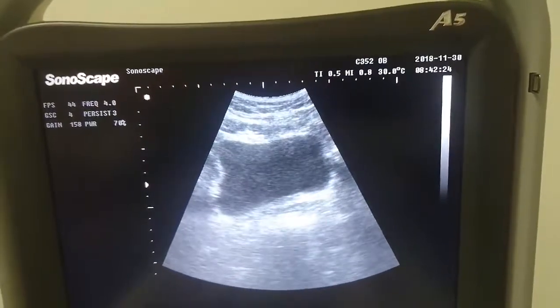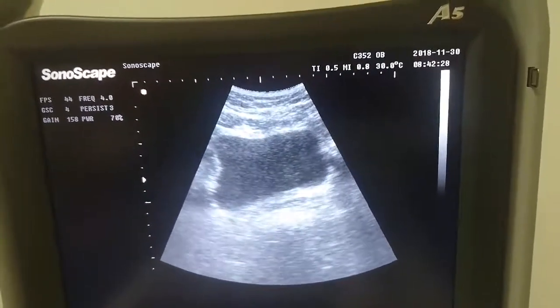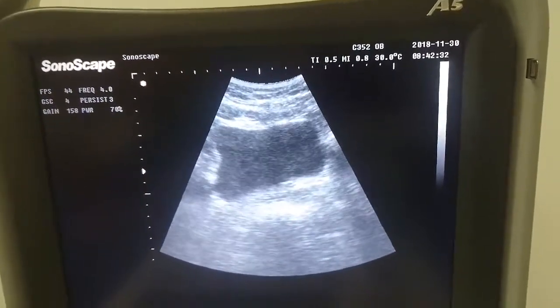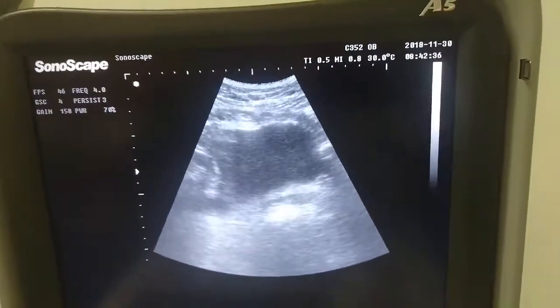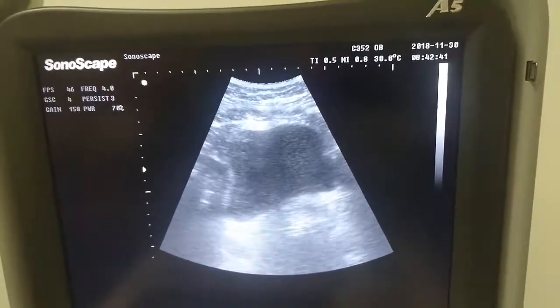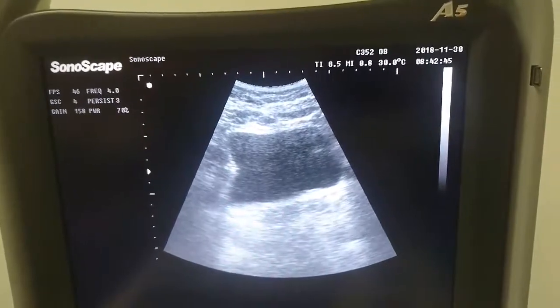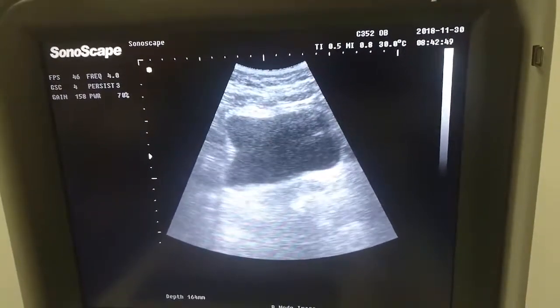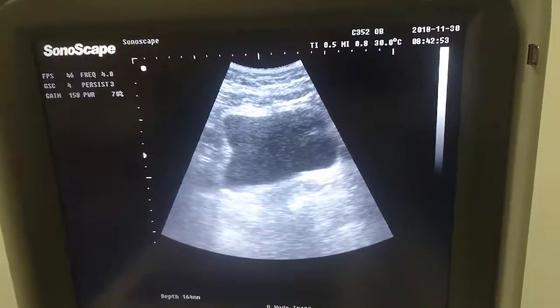So I wouldn't actually get Sharon to do her exercises in this position — I would get her in another position. The other thing I'd assess is loading. Sharon, can you lift your head up for me? And back down again. You can see how it goes up and back down. That side that wouldn't lift before is dropping quite a bit when Sharon lifts her head. It's normal to have a little bit of a drop but not a large one. That just tells us that the support is not so good on that side.